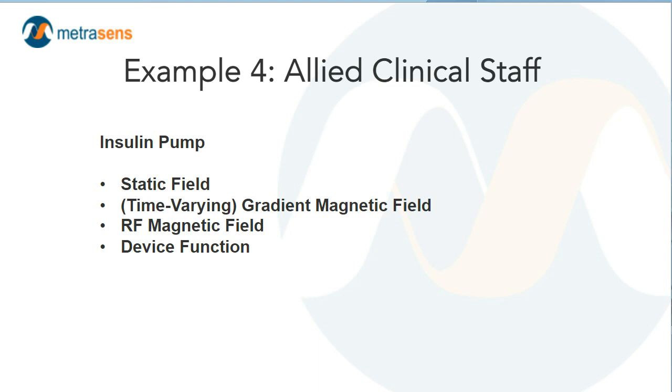But all of those things excepted, device function is a major concern for insulin pumps. Think also about the recent news story, the weighted vest with the MR technologist radiographer in Sweden. We need to make sure that the clinical staff, including MR staff, that we conduct effective screening for everybody.